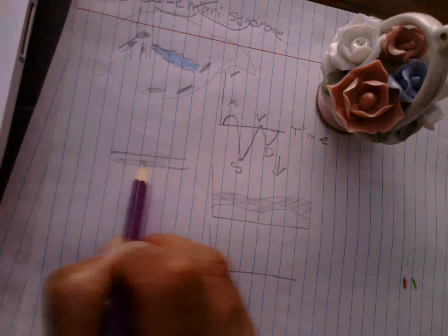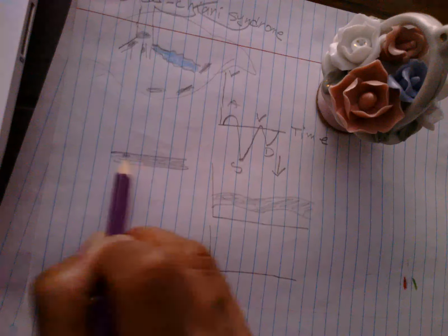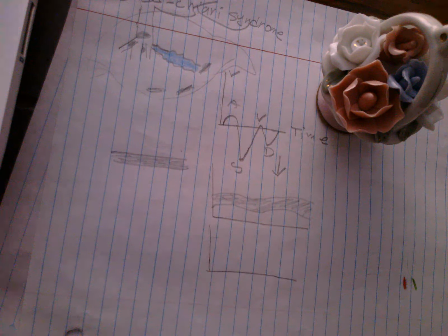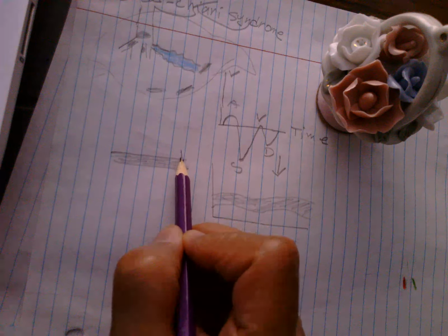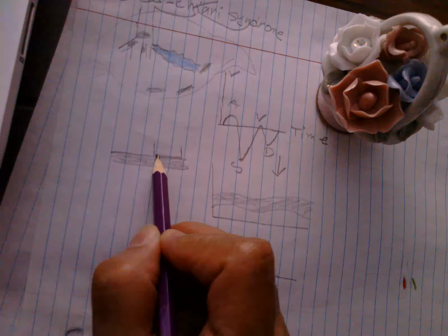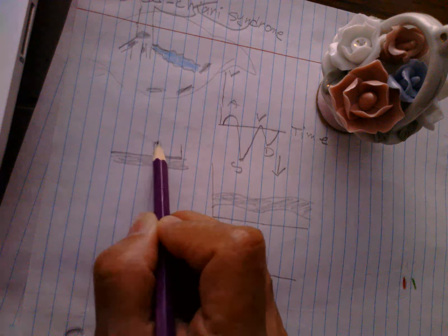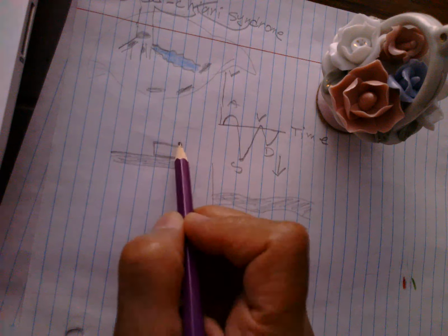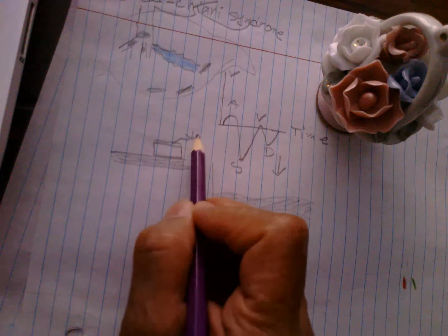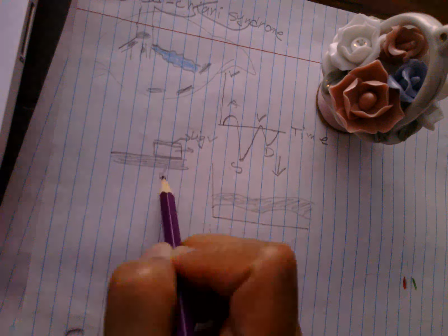So if we have a normal IVC here in sagittal, in the left lobe of the liver, we have a caudate lobe that is about 2 to 3 centimeters. And anterior of that is the ligamentum venosum, caudate lobe, IVC.